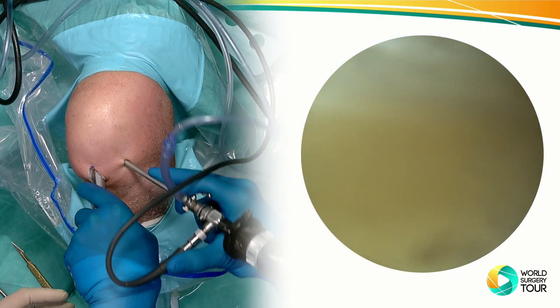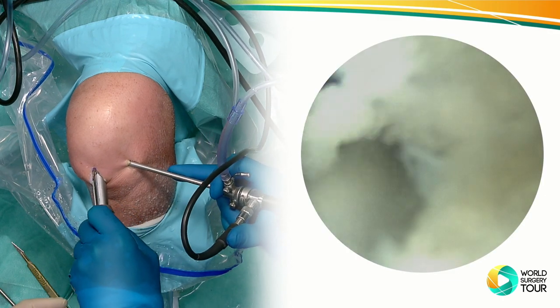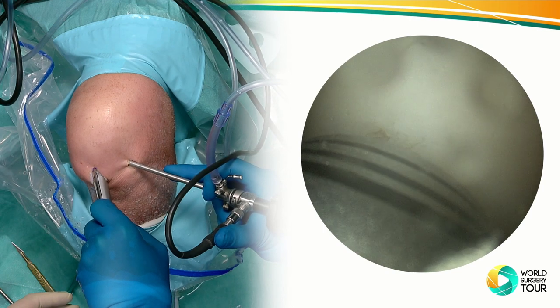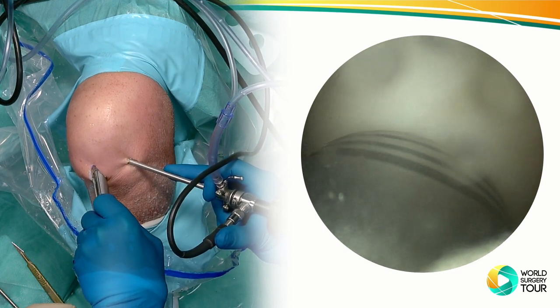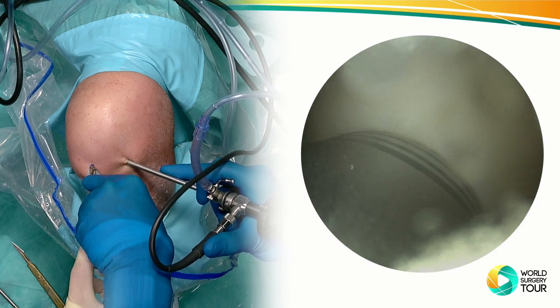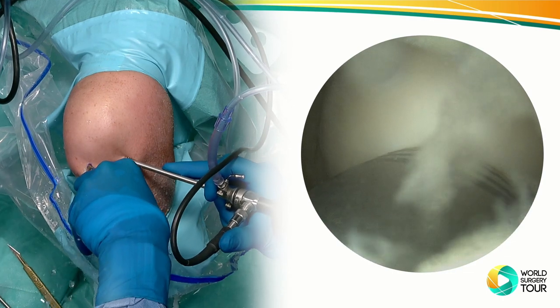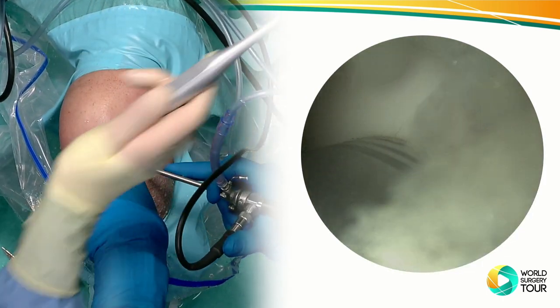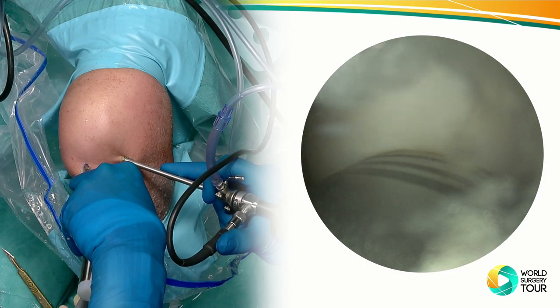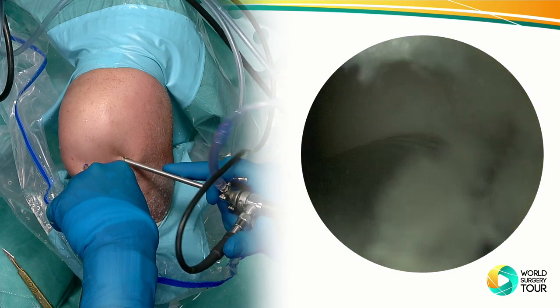It still needs to come in. It's not in yet. Here we slowly go. Okay, like this? Yeah, here we go. Now he can remove the cannula, and then he takes a hammer, removes the trocar, and then he's going to bang it. Important: you see these lines, they need to be banged in deep enough that the third line is flush. The window is important as well.